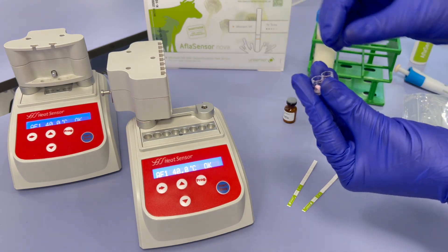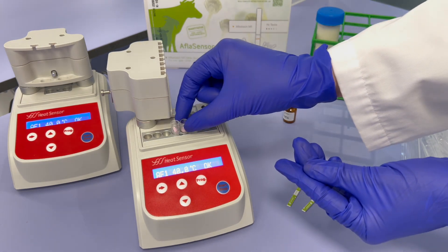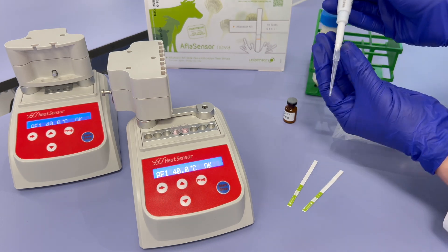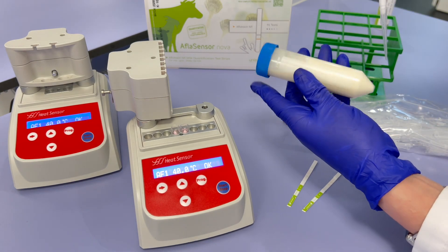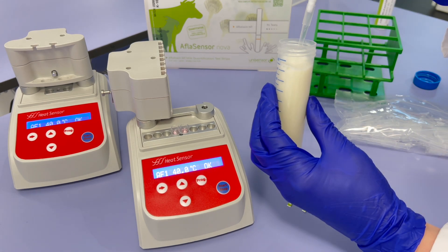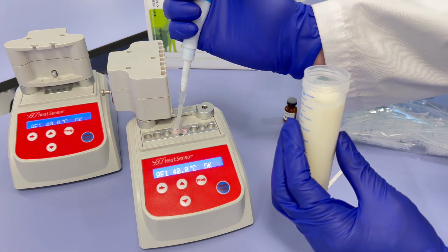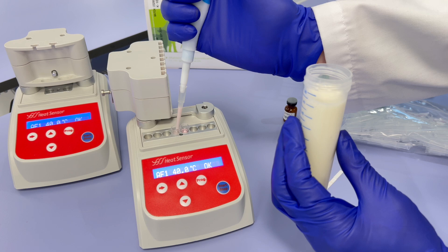Place the reagent microwells in the heating block, which should display 40 degrees Celsius. For each sample, attach a new disposable tip to the micropipette and swiftly transfer 200 microliters of milk into one microwell. Then gently mix six times using the pipette to homogenize the sample.